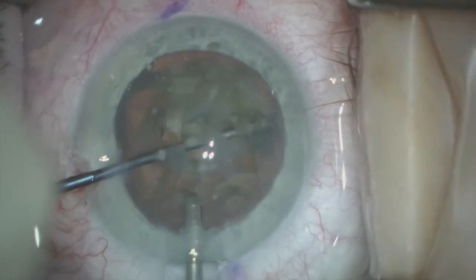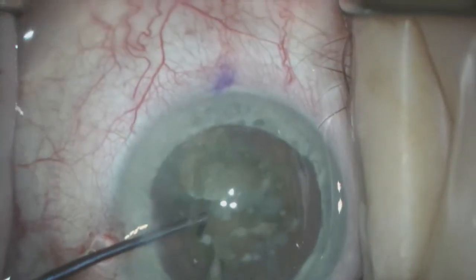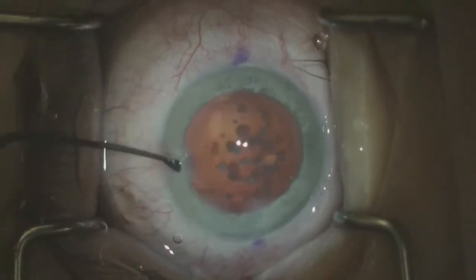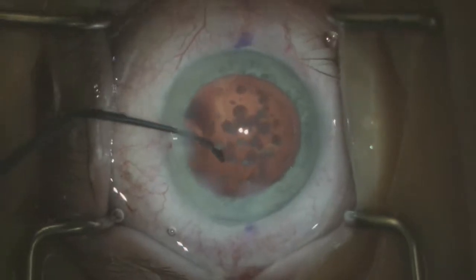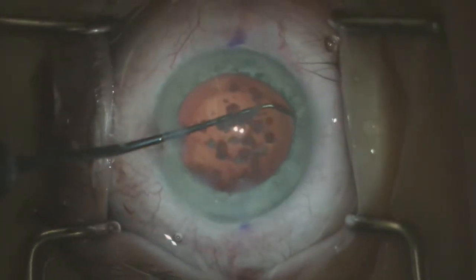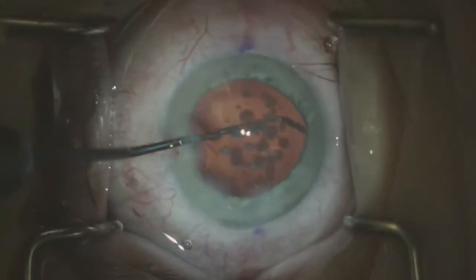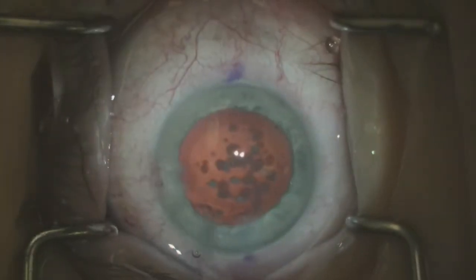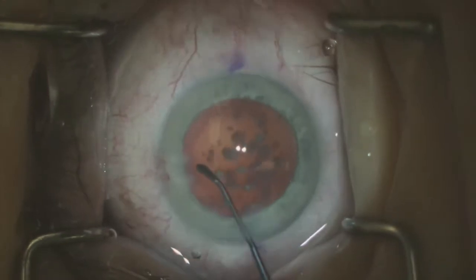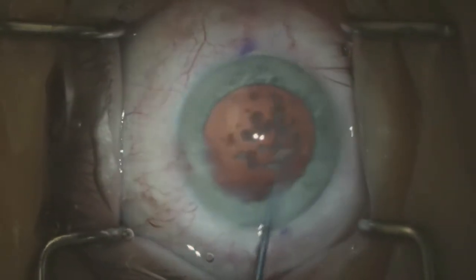We use our usual divide and conquer technique, being careful to watch the edge of the capsulotomy to make sure it stays intact — which it does. Once we've removed the whole lens, we use the Singer sweeper to polish the posterior surface of the anterior capsule. This instrument is also manufactured by Epsilon Instruments and works very well.